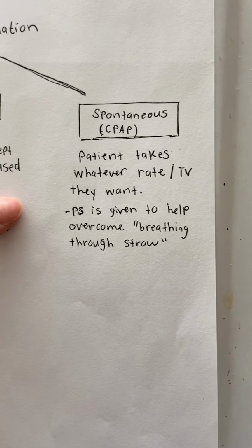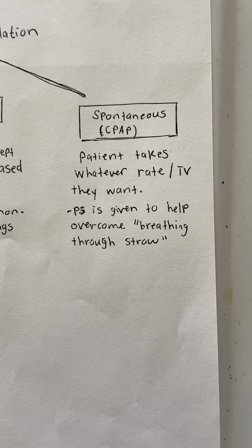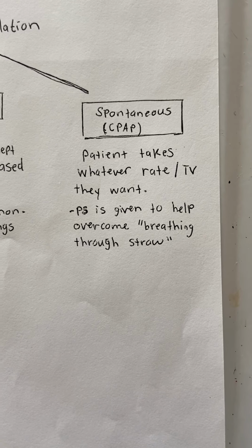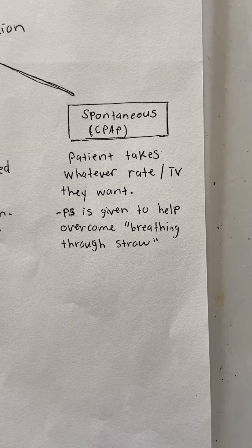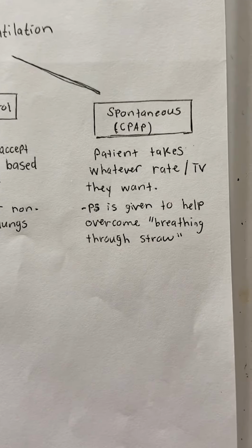Lastly, spontaneous mode, or CPAP, we call it frequently. So this is basically our weaning parameter. The patient needs to be able to tolerate CPAP, obviously, before we can extubate them. This is where the patient takes all of their breaths. They can breathe as frequently as they want. They can take as big or as little breaths as they want.